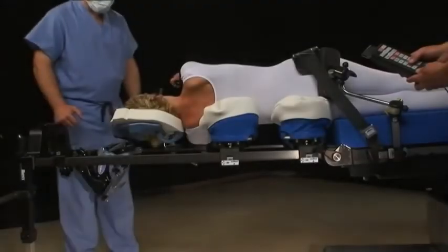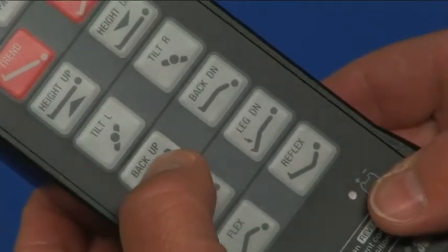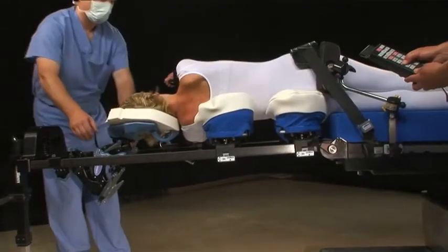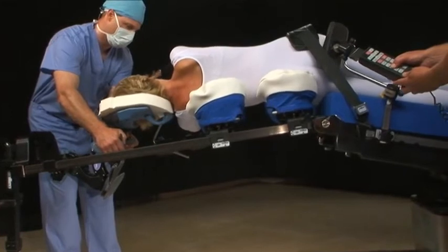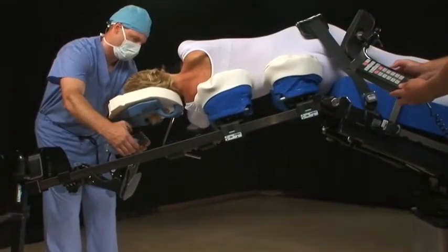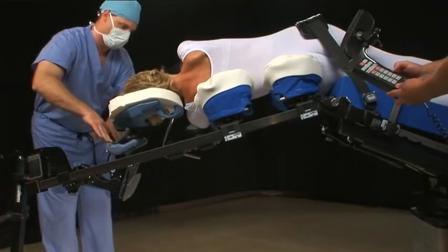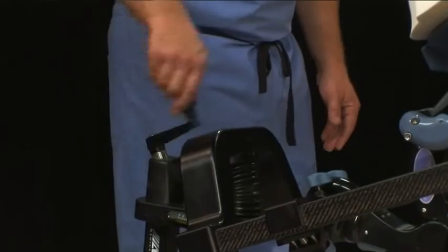Powering the OR table will flex the patient and, in turn, open the lateral disc space. While flexing, readjust the C-Flex so that the patient's head is properly supported as it shifts with increased flex. Lowering the frame height will increase flex further.